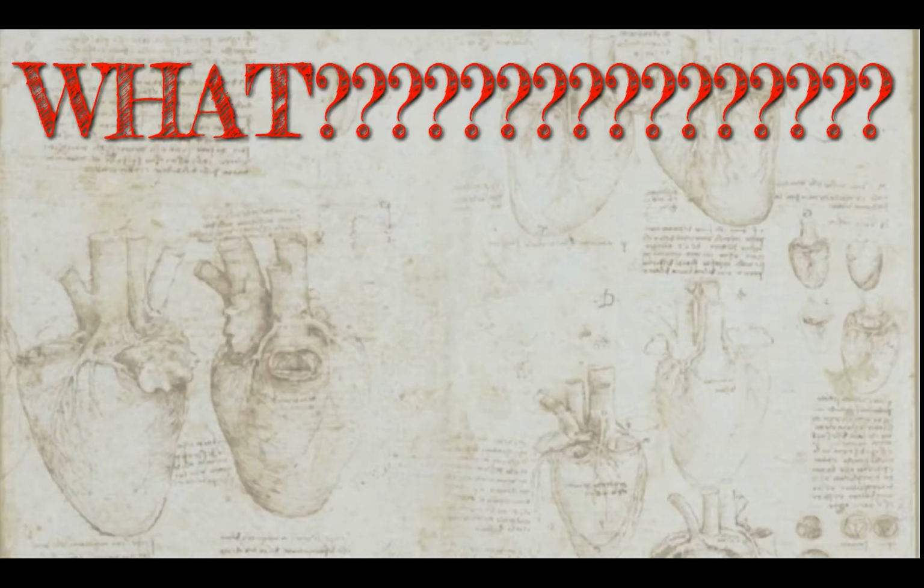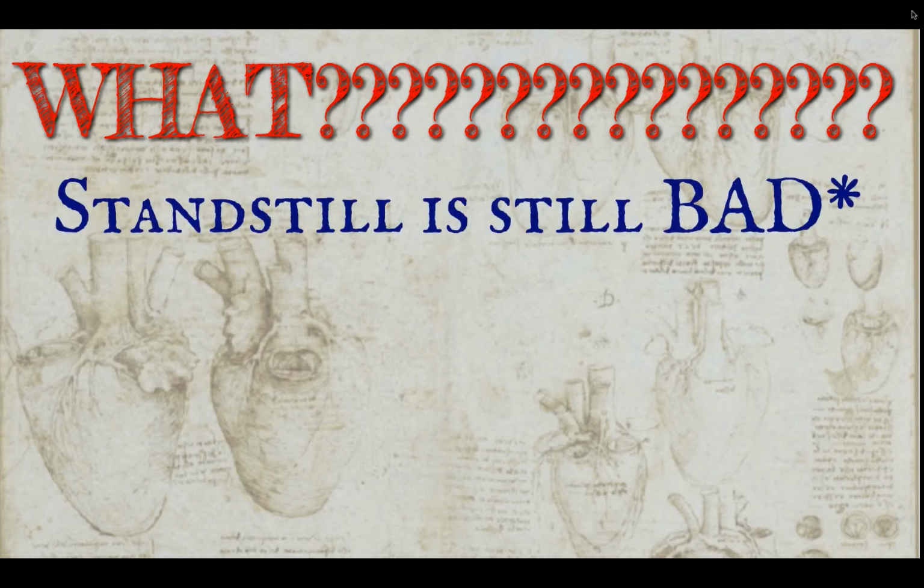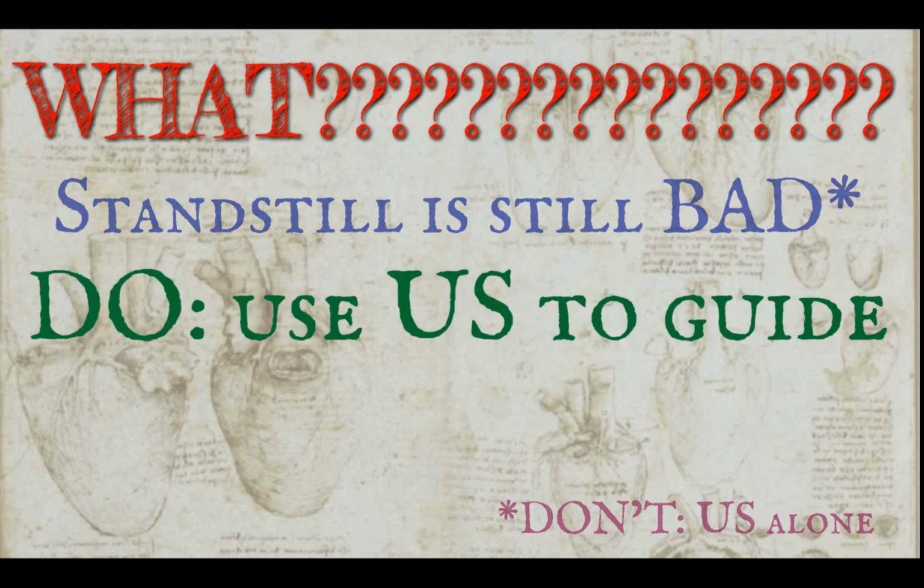So, what? Let's listen up here for a second. First, this trial did show something we've all suspected and have relied on in our resuscitation. It definitely showed that cardiac standstill is very bad. It just asks us not to rely on this alone and use the rest of the clinical picture to guide management. And we'll talk in a moment about how to delay the decision to stop the code while you synthesize that same clinical data. We also learned from the REASON trial and some of its post-hoc analysis that when ultrasound is used to guide resuscitations, you can get markedly improved results.